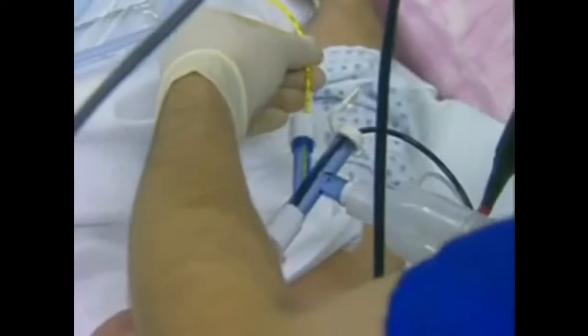Once the carina is visualized, the bronchoscope is advanced into the section of the lung which is going to be deflated. After the area to be blocked is entered, the bronchoscope is held stable and the loop with the endobronchial blocker is advanced and pushed off the end of the bronchoscope. After slight retraction of the bronchoscope, the endobronchial blocker may be either advanced or retracted to place it in final position.